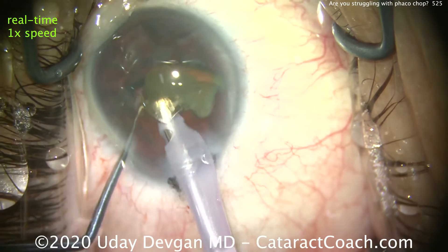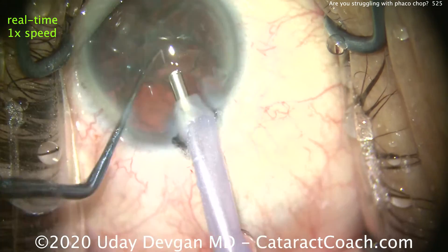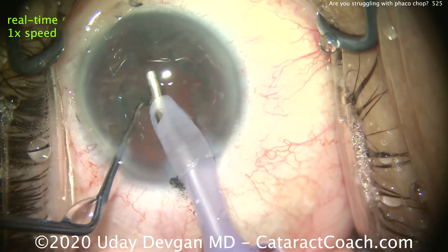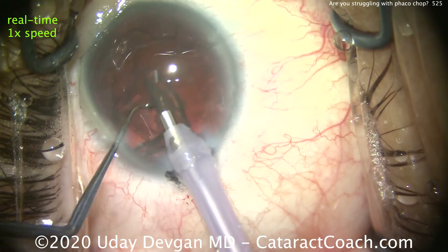We're almost done. Nucleus is removed in well under a minute. And even with removal of the epinuclear shell, we're still just about one minute of surgical time. That's a very minimally invasive surgery, and patients are going to have a beautiful outcome. Taking down the epinuclear shell. And next time you have a chop case, I want you to keep these pointers in mind.